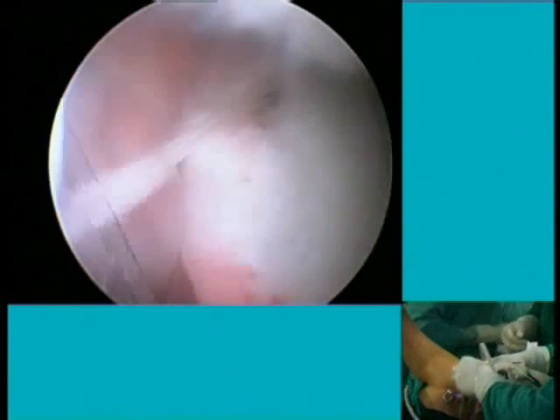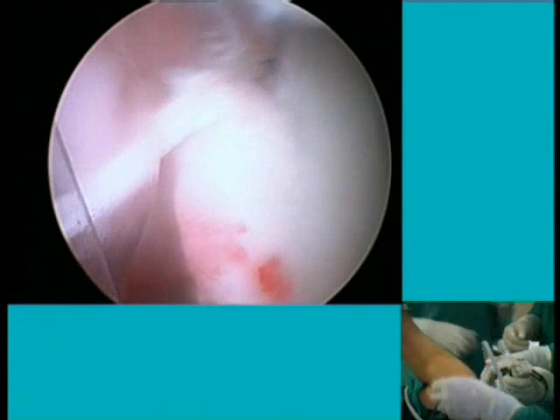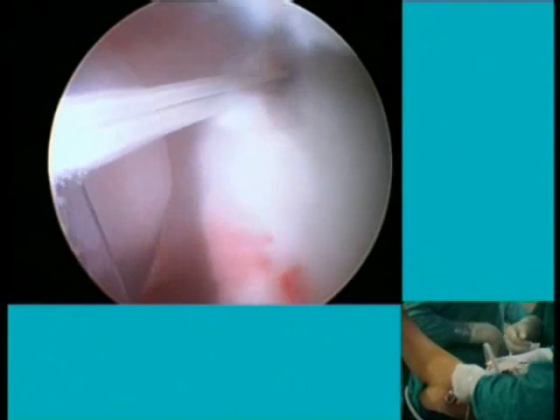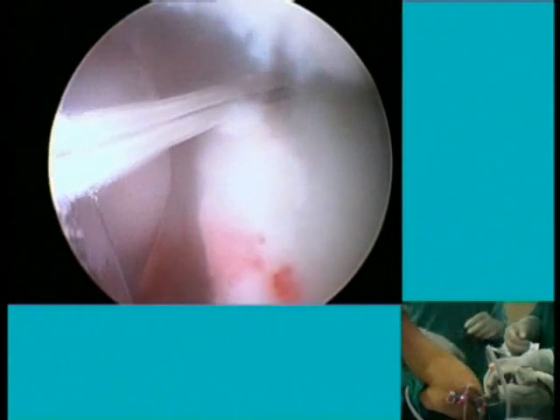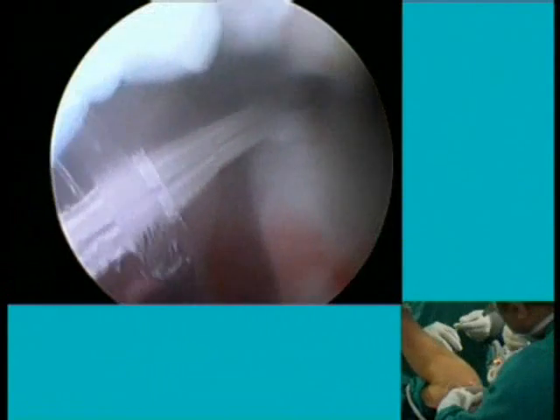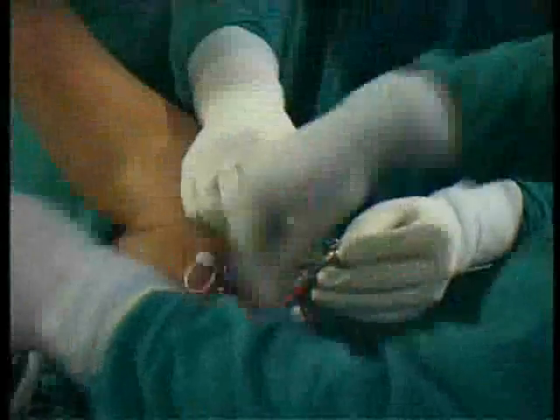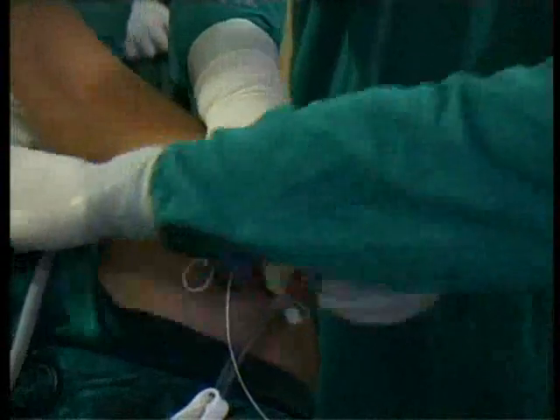And I am going to take this handle out. That shift gives you a good pull. I'll check it with the good pull now. So I can just move the whole patient with this. That looks good. That seems like a good one. Now I'll go back to my posterior viewing portal. So this is only for your most inferior placement of the screw. Yes.